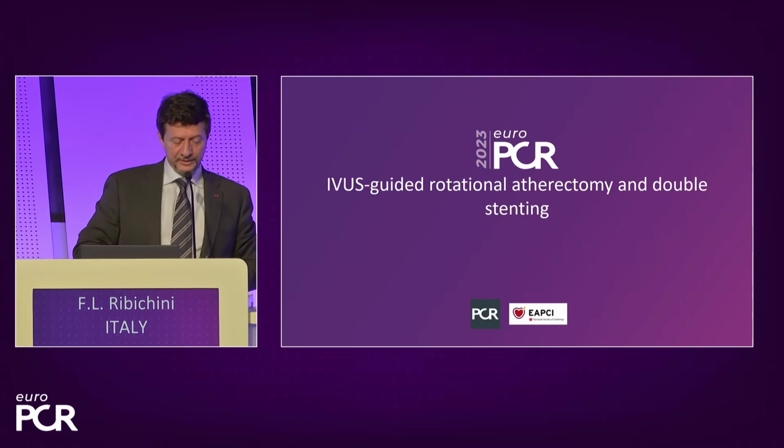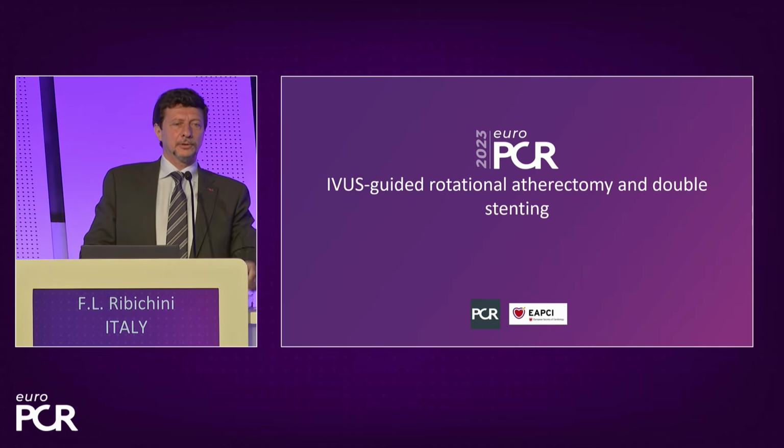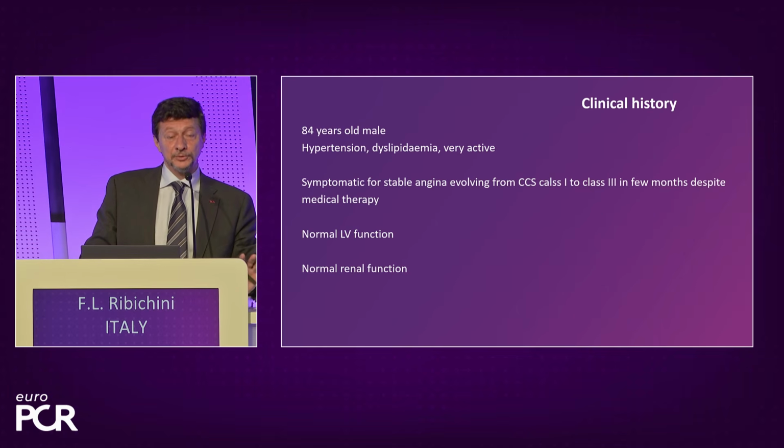We recently published with Flavio the EuroPCR Euro4C consensus document. Yeah, thank you, Emanuele. We are very proud of this. It's a work that took more than a year of a group of experts, and is going to be published in the European Heart Journal in the near future. So we can, for the first time, show you, and you can also take pictures of the algorithm, which is based on the use of intravascular imaging, because we also have an algorithm for those who are not so lucky and don't have intravascular imaging, and the procedure is guided only by angiograms.